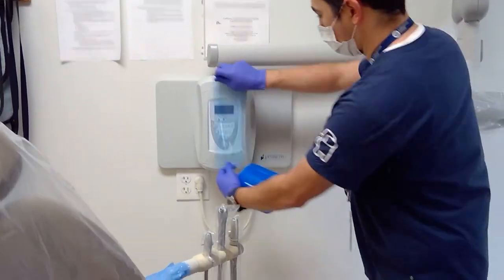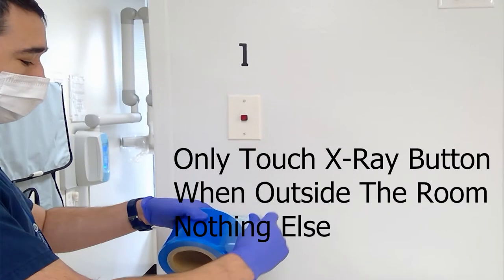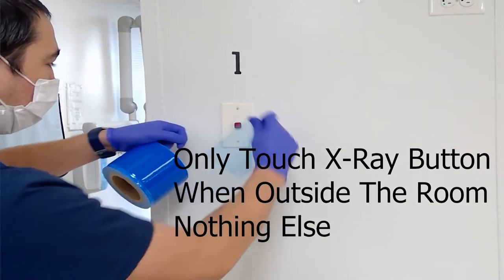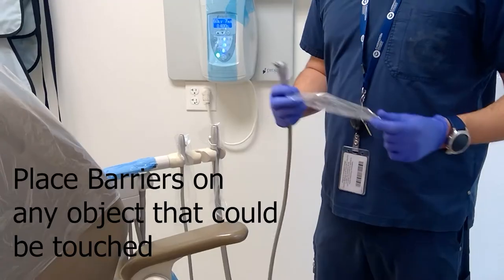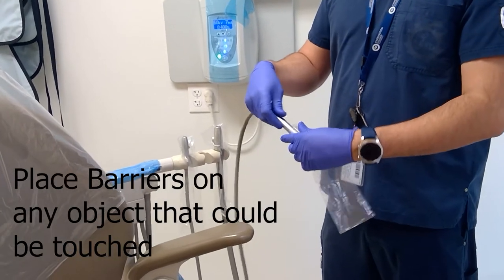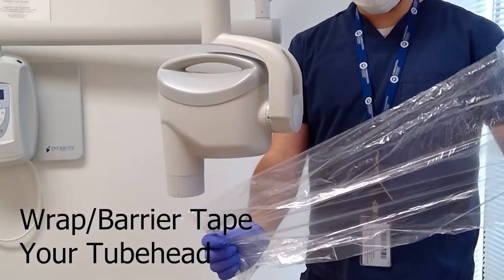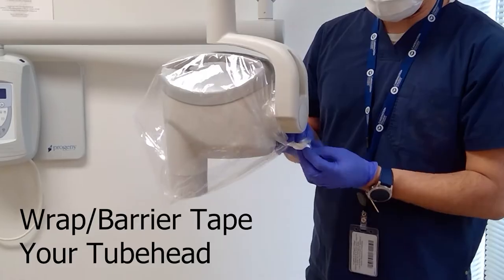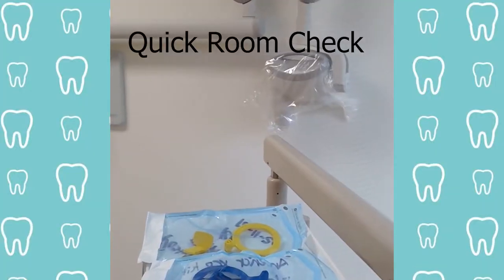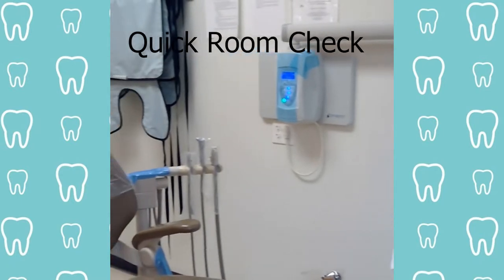Start by placing your barrier tape on your control switch and your control panel. Turn on the system. Place the sticky tape on the dead man's switch. Be sure to not touch anything outside this room as your gloves may be contaminated. Place barrier sleeves or sticky tapes on any other important objects that we may touch. Wrap your tube head in a barrier sleeve or place sticky tape on the important parts that you may touch. Quickly check your room to make sure that all possible areas that may be touched are protected and ready to go.